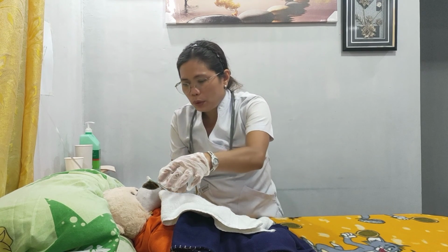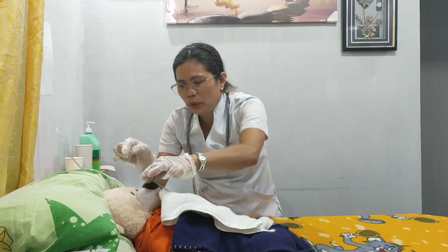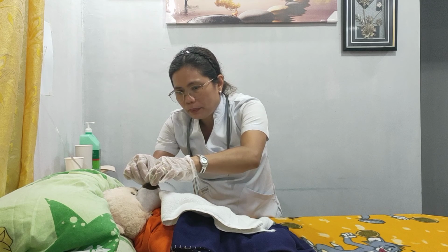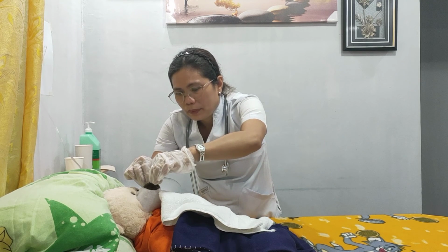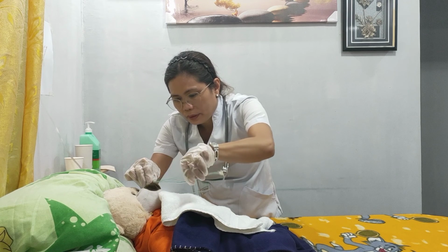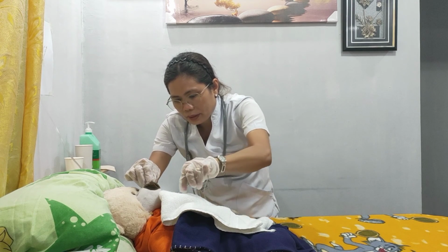Advise the patient to take a deep breath because we are pulling the tube out of the client's nose. Okay, ma'am, I want you to take a deep breath because I'm going to pull the tube out of your nose. Okay? Take a deep breath, ma'am. Here we go. Alright.